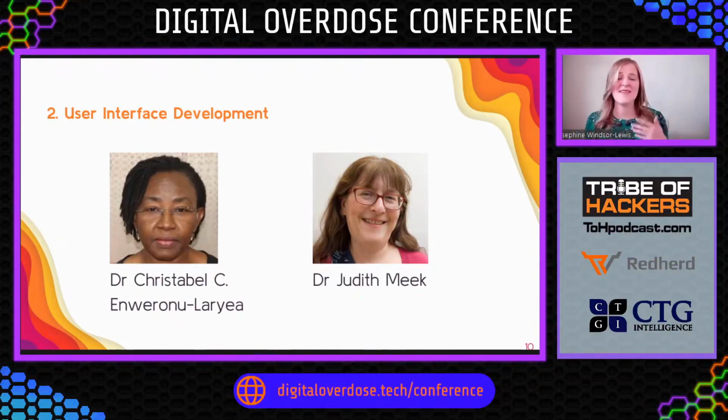If you're trying to take a picture and you make a click noise, they blink, they move, they're trying to hit the camera because they think it's a toy. Make it silent. So I did. They also wanted something way more simple than what I'd put together.